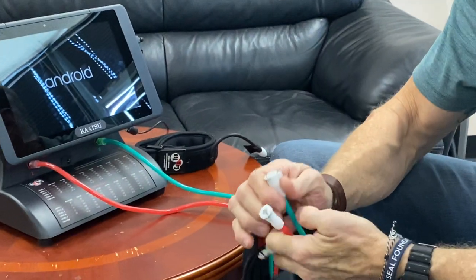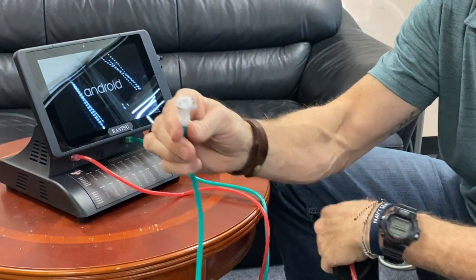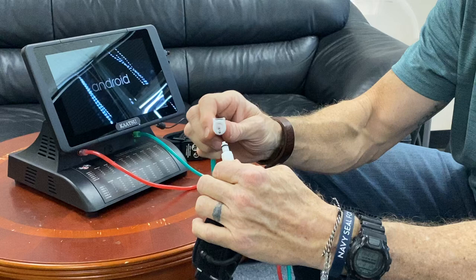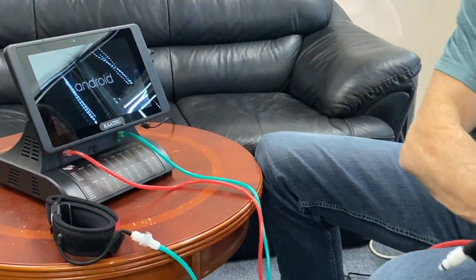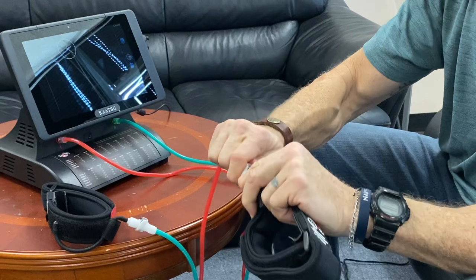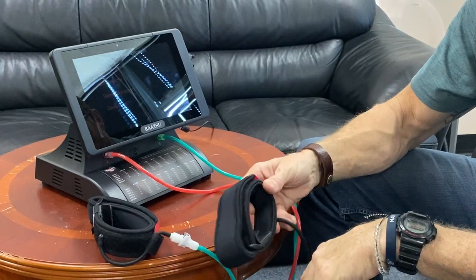So while the machine boots up, let's run through connecting the bands. These are very simple quick release. These female fittings connect to the bands. These male fittings — you just press them in, give it a little twist, and you'll hear a click. Same thing with this one. Put both bands in — click — and now you can go ahead. These are arm bands and we'll walk through this a little bit later.